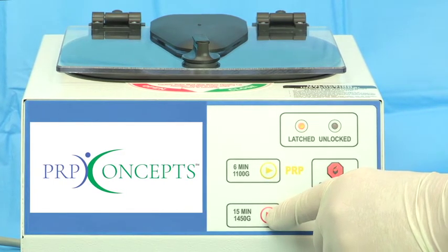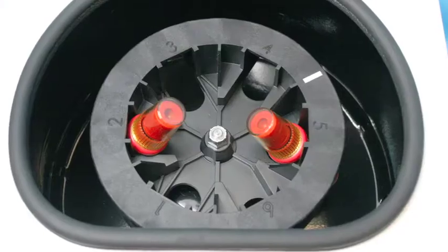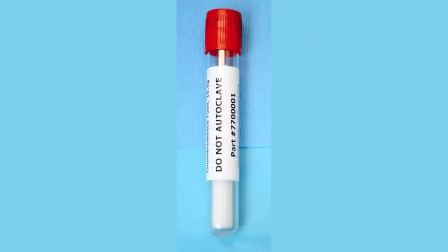When using the Drucker centrifuge, push the red Prfm button. Place tubes opposite each other prior to centrifugation. Use red tube counterbalance when necessary.